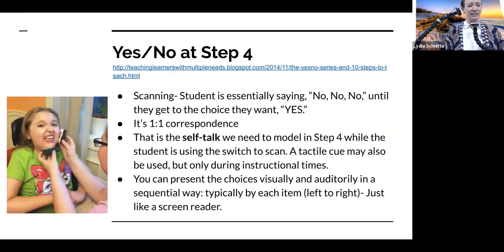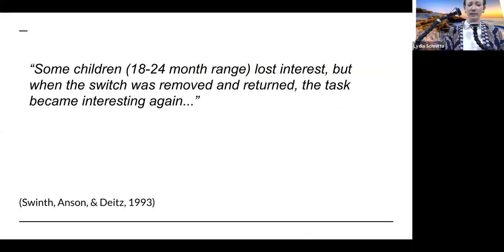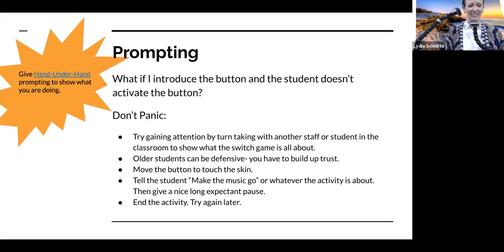Oh, I knew I forgot something. There were 3 slides that were out of order, so we're gonna go back to those. Okay, so something that always comes up. What if they don't activate the button? How do we prompt the student? And I have some tips here. 1 is don't panic.